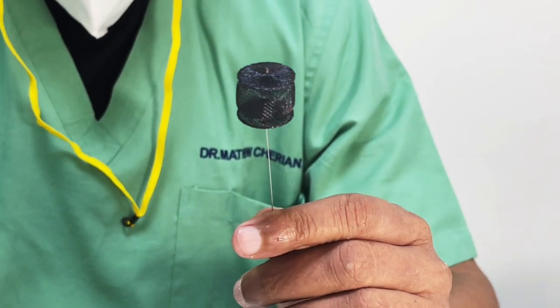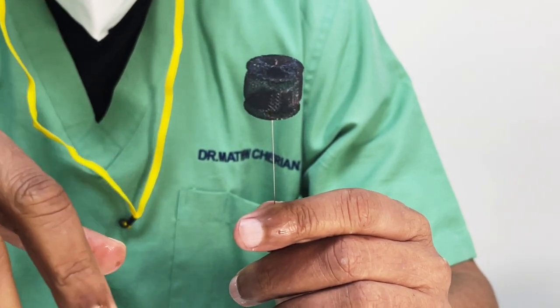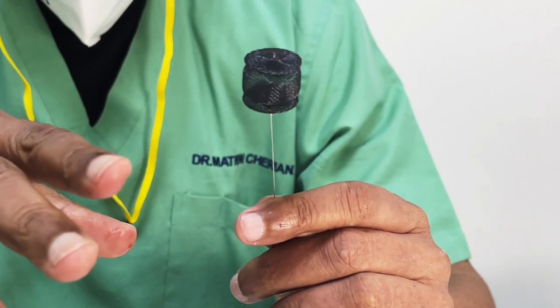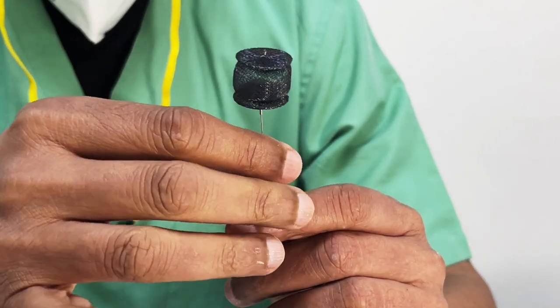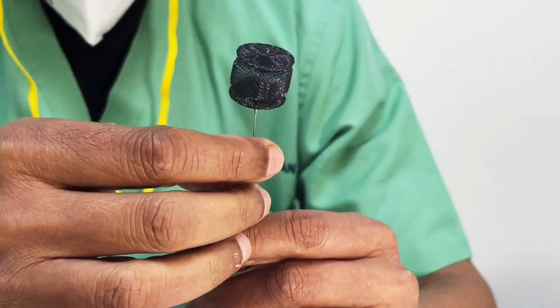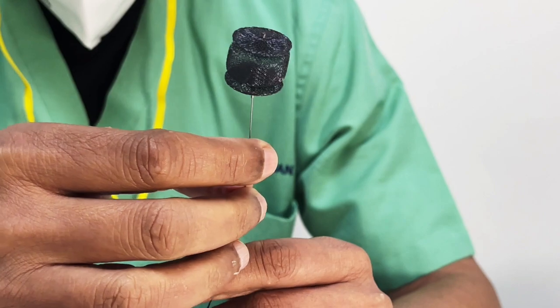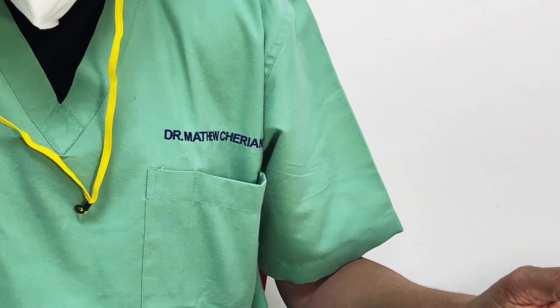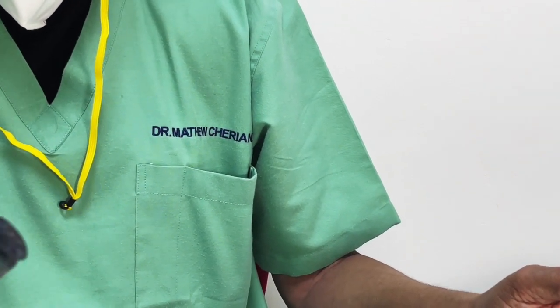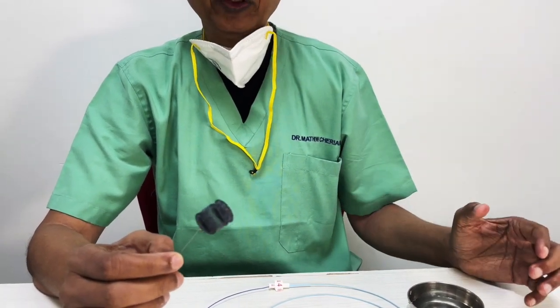Then come the plugs, which are the type 4. The type 4 are very similar in construction, similar in deployment. Only difference is it goes through a diagnostic catheter, and cannot be used in a vessel more than 6 millimeters. Extremely good for occlusion of internal iliacs, GDAs, or any vessel in that size, including pulmonary AV fistulas. And we have used them also for parent artery occlusions, where we want to take the internal carotid artery out, or situations like this, right? So that is about the mechanical occlusion devices that we use in the periphery. Like I said, you can still switch it and use it also in neuro procedures, provided you don't go intracranially.